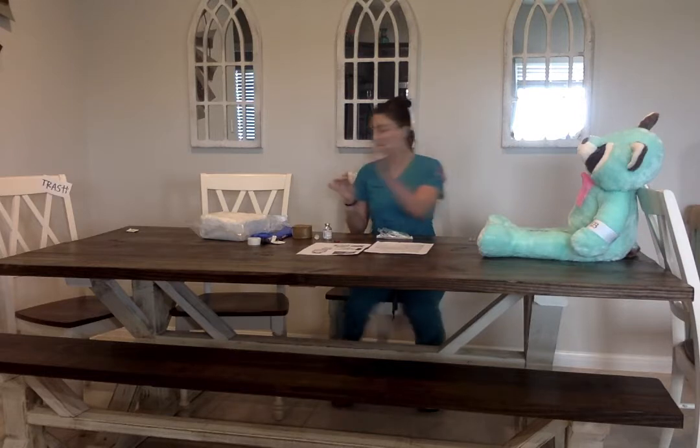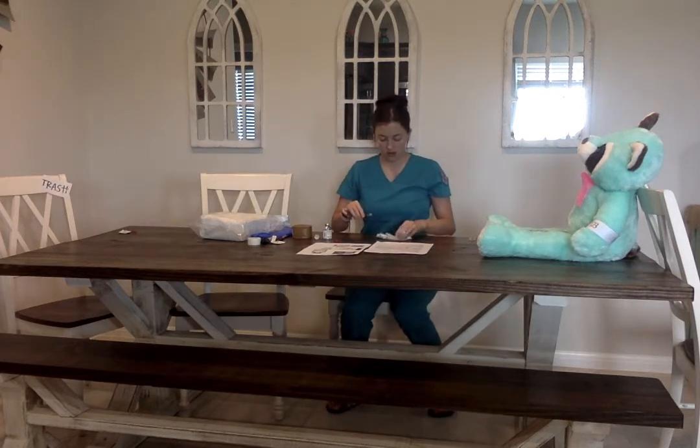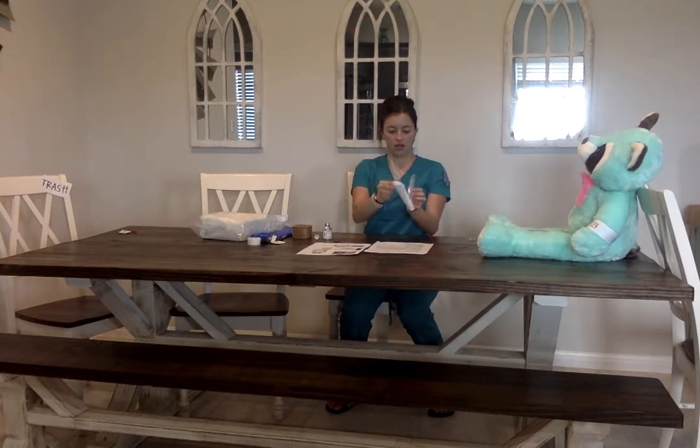Throw this away in the sharps. And I'm going to protect this end because that's the most sterile part.